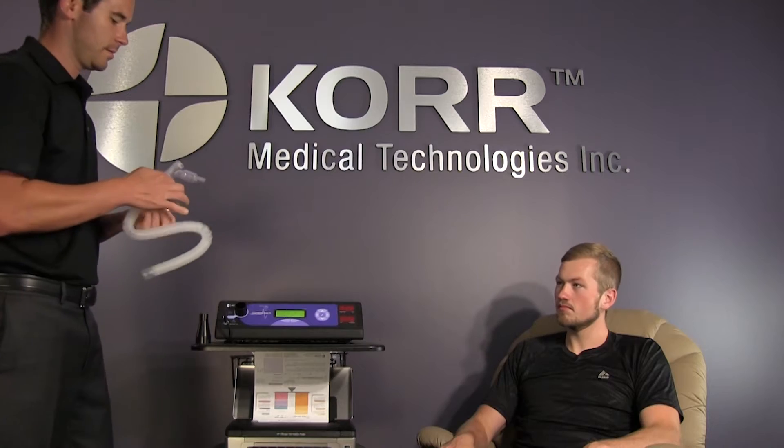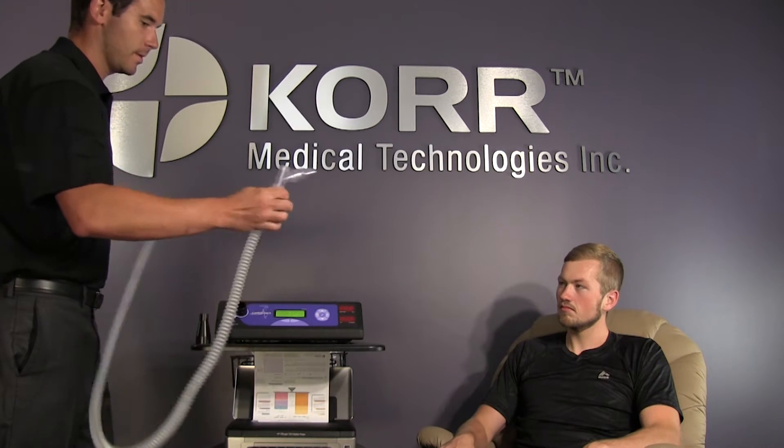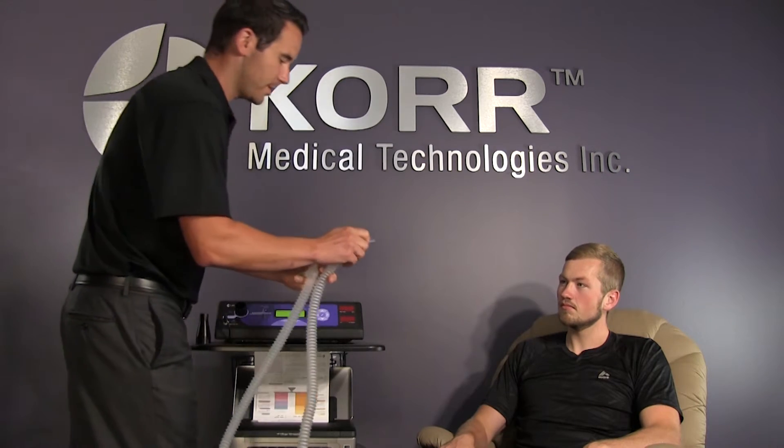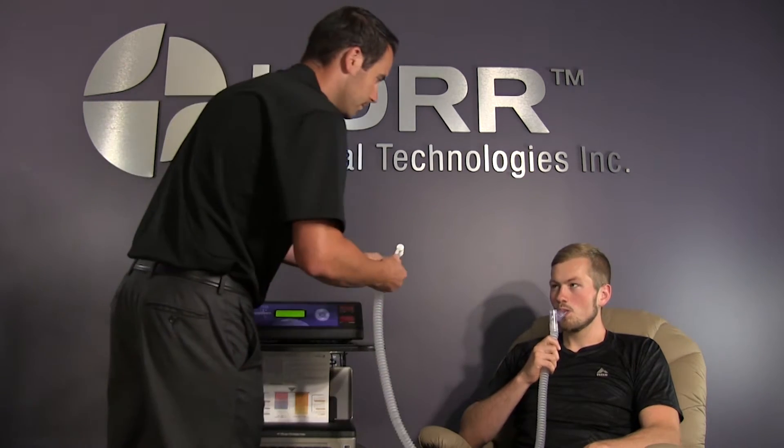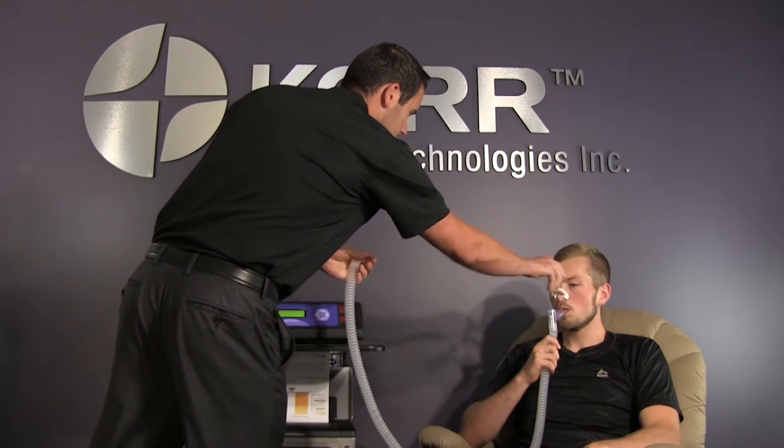With the funnel in place, you will be able to connect your MetaBreather tube to the CardioCoach. Expand your MetaBreather and place the mouthpiece in the client's mouth. Place the nose clip on their nose. Make sure they keep a seal with their lips around the mouthpiece so all the expired air is collected throughout the entire test.